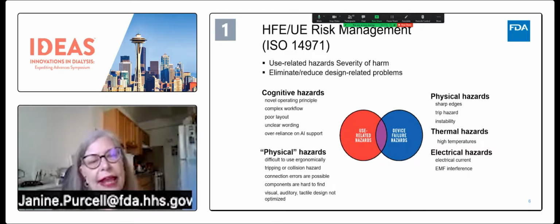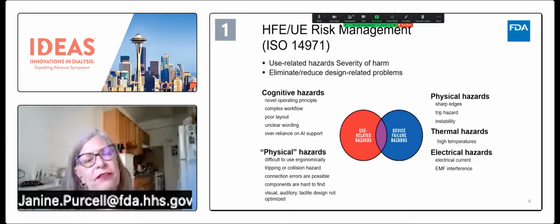Think about how you lay out information, either on your software user interface, and also in instructions for use and quick reference guides, and also how you present your training information to people. Think about the vocabulary and the grammar that's being used. I've seen challenges, and it's a big challenge if you're bringing something from another country into the United States, the kind of great care that needs to be taken with the writing and the translation of those materials.